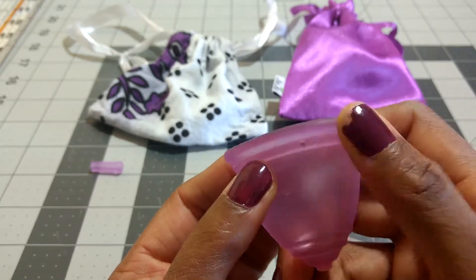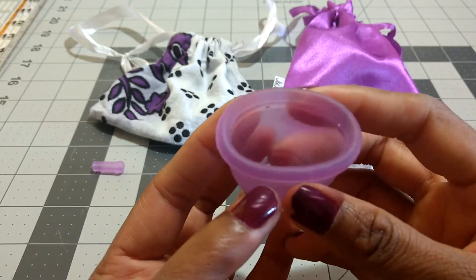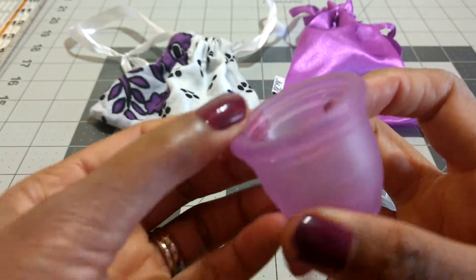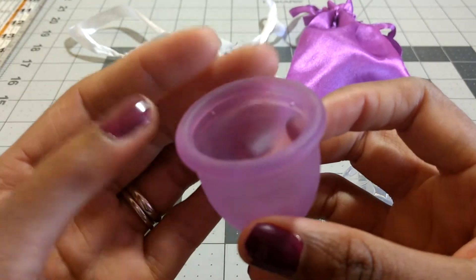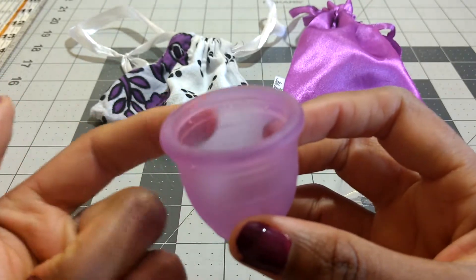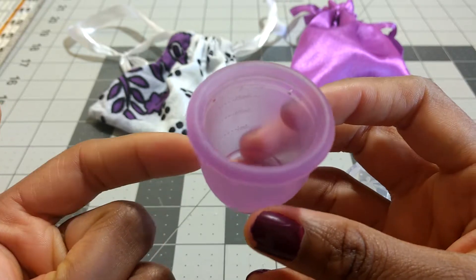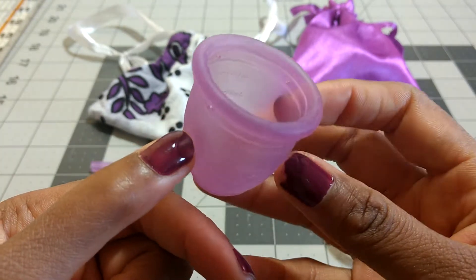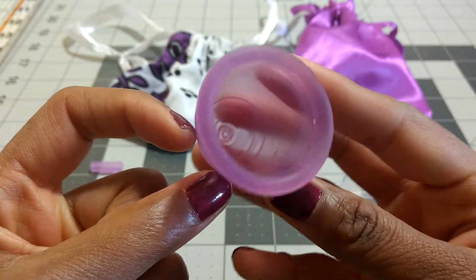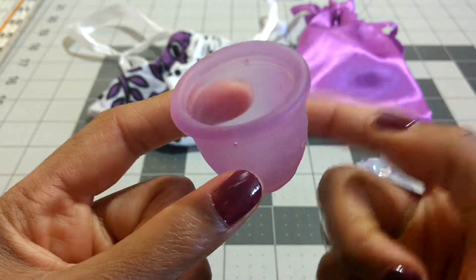There's a secondary rim, but there's not any major difference in firmness between the main rim and the secondary rim. There are some measurement lines — oh, I never even noticed this — it actually says 'Ruby Cup' embossed on the inside. There are milliliters marked on both sides of the cup: a 5, 10, and 15 ml mark, so it measures the volume on both sides.